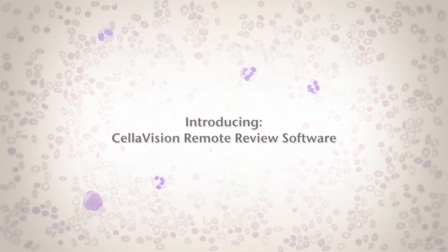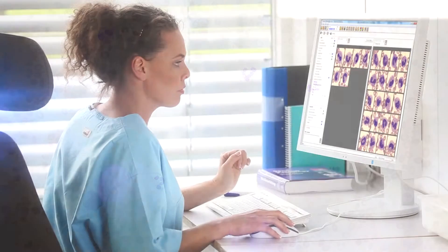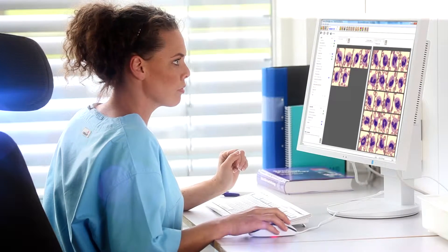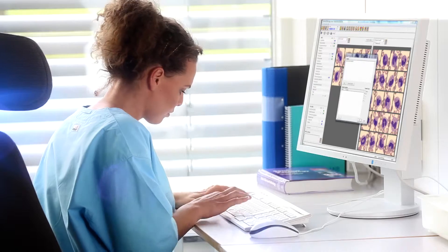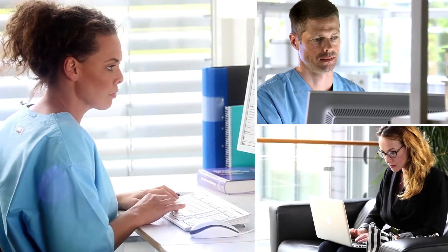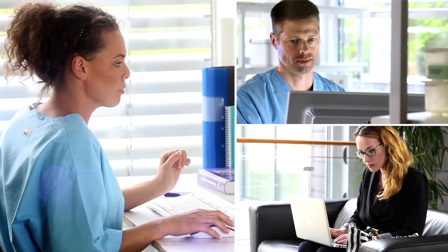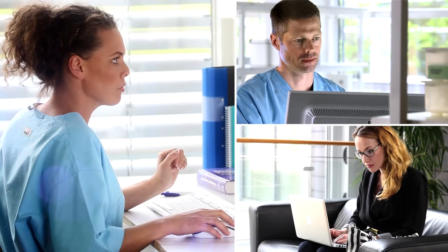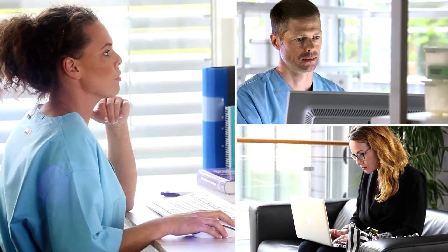The CelliVision remote review software is a key feature of the CelliVision product offer. The software makes it possible to review, adjust, and verify cell differentials from anywhere within a network, creating opportunities for more flexible and efficient utilization of resources, staff, and skills.